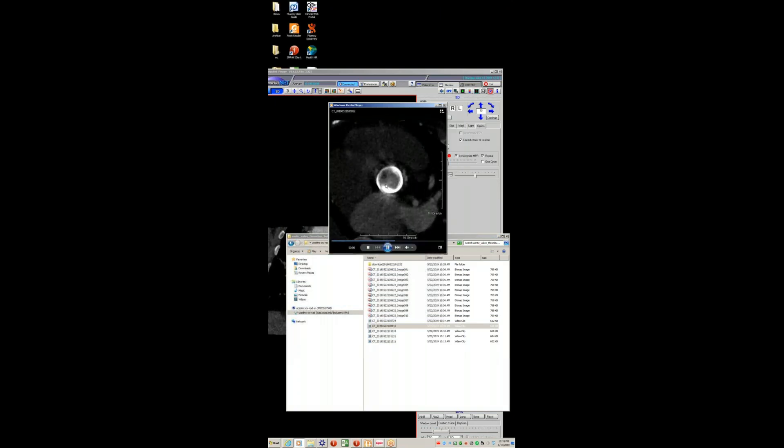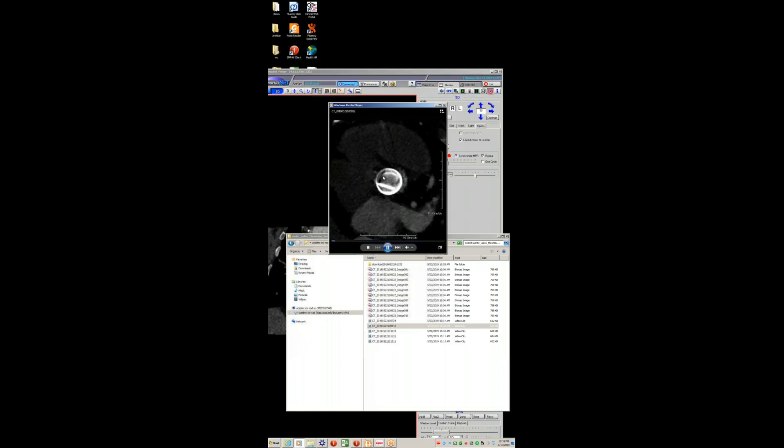The valve really does not open and close well because of that thrombus, which is literally straddling the prosthetic valve like a door jam. The patient had free AI across the valve because of that thrombus — just impressive findings.